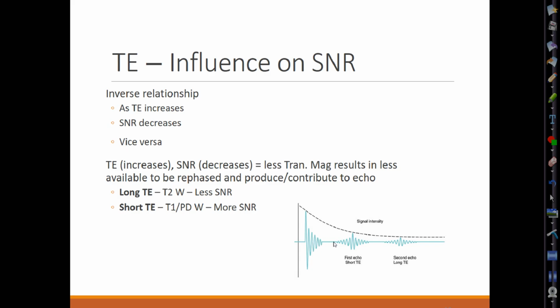FID. Your FID, good. And then we have a 180-degree refocusing pulse that happens around this time frame to regrow the signal. And then it regrows to peak amplitude, TE, and that's usually where we're going to be recording our signal. So this slope right here is associated with that T2 decay slope. And you can see here, if we have another 180-degree refocusing pulse, yeah, it regrows our signal, but it's not going to regrow as much because we're still going to get a general trend of decreasing signal as we go along. This is what we call a dual spin echo, where we get 2 echoes. The second echo is always going to be less than the first echo. There was less transverse magnetization to refocus on that second echo.